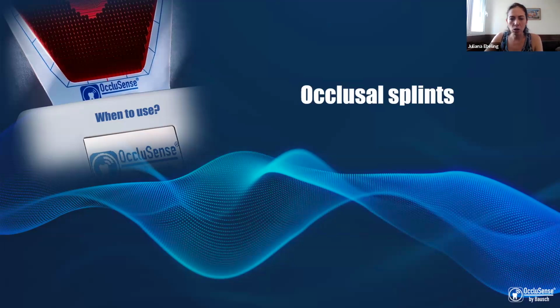Then I start to use OccluSense to adjust the intensity and the distribution of these contacts. This is a much easier way to use OccluSense for oral rehabilitation, for the final phase where papers and scanners are not able to show me if I have a balance. And this is really, really helpful. I never finish an oral rehabilitation without this refinement of the adjustments.